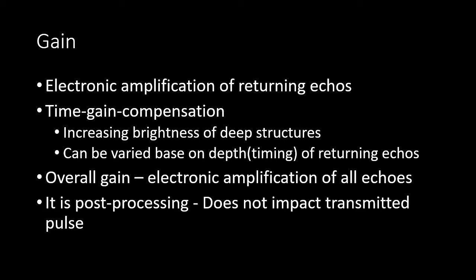Now let's discuss gain as it compares to power. Gain is really an amplification of the echoes that we receive back to the probe. So unlike power, which is impacting the echoes that we are sending out from the probe, when we receive the reflections back, they stimulate the piezoelectric crystals, generate little electronic impulses. We amplify those electronic impulses to increase or decrease the brightness of our image.